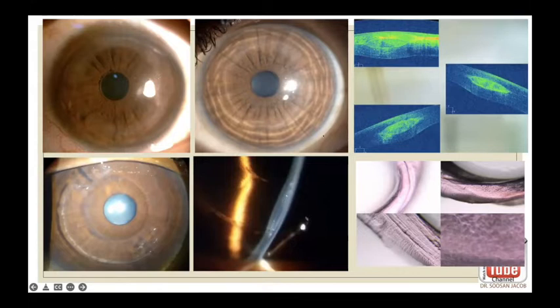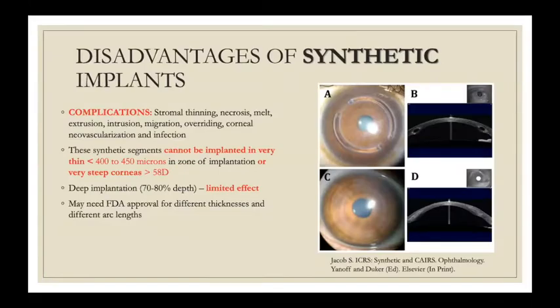And these are anterior segment OCT images showing very well placed quiet segments. These are light microscopic images of the CAIRS segments, which show very parallel, longitudinally oriented, and very quiet looking lamellae, which are seen on light microscopy. What are the disadvantages of synthetic implants which we are actually trying to overcome with CAIRS?